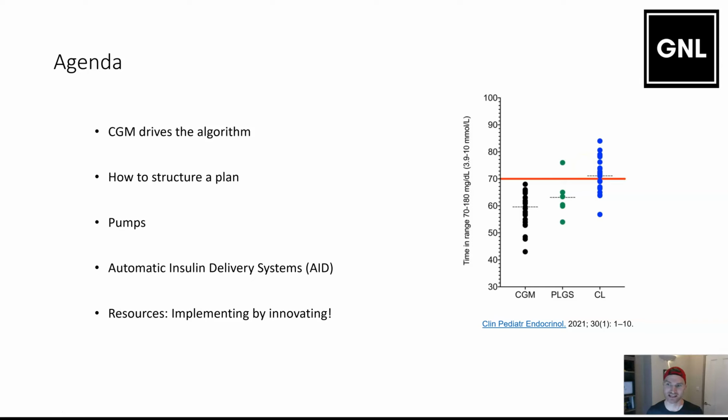However, exercise is the biggest challenge they face. These automated insulin delivery systems are unbelievable overnight, because you're asleep, and all you have is the insulin going up a little bit when the glucose starts to rise a little bit, and when the glucose starts to fall, it takes a bit off, and it works beautifully.